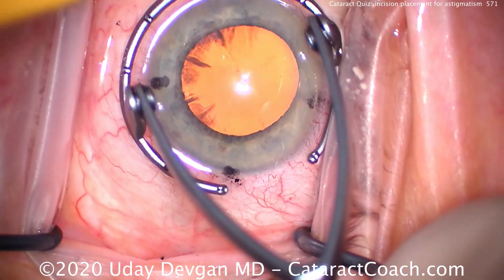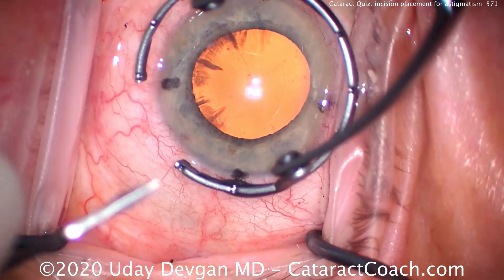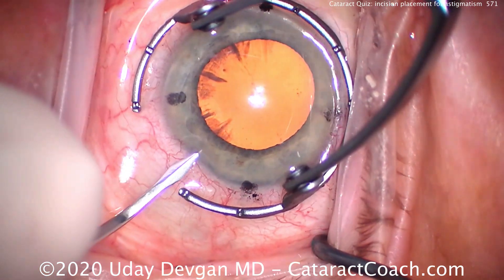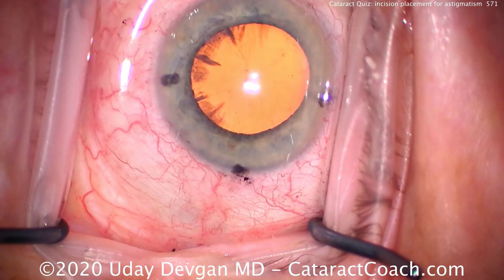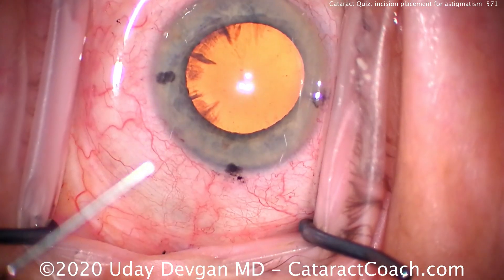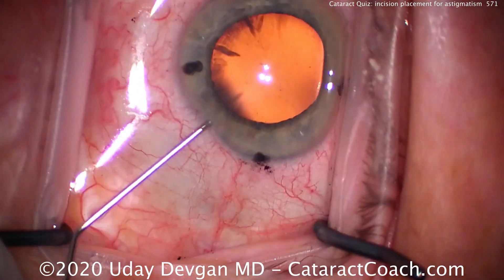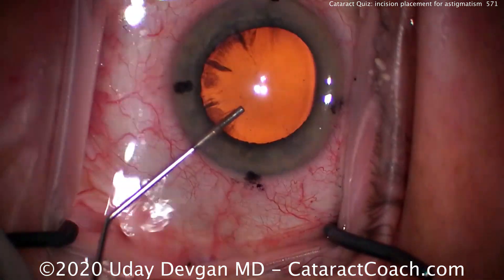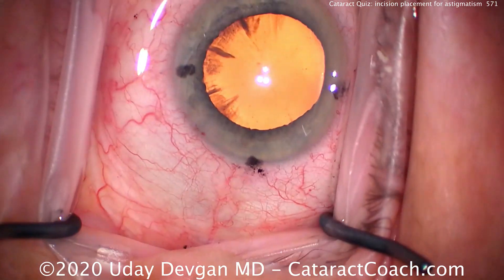So now, to make the incisions, the paracentesis can be made anywhere. It's not that critical because it's only about one millimeter wide and will have no significant effect on the astigmatism. The critical question is where do you make the main phaco incision?